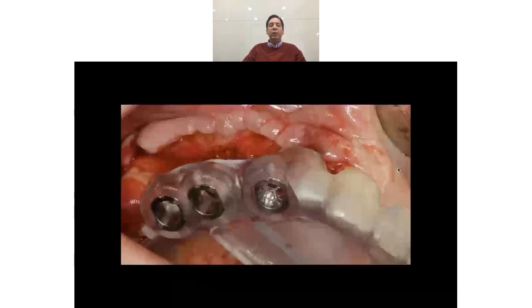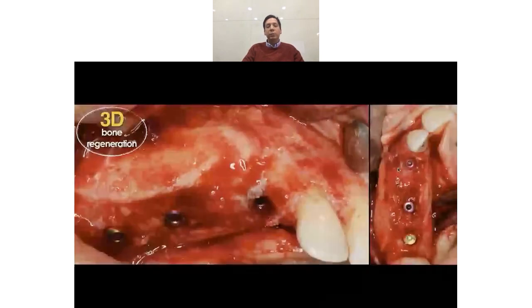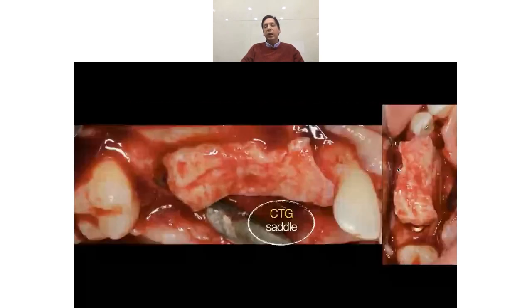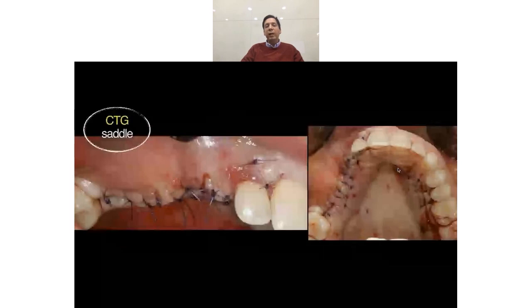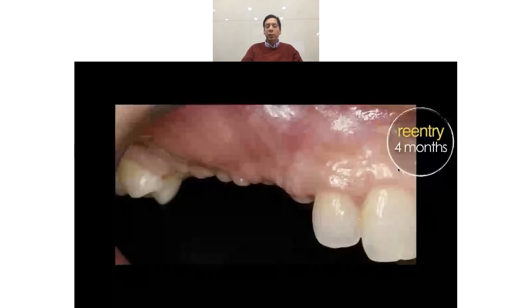And we have no problem to place three implants, one in the canine, one in the second premolar, and the other in the first molar. The first premolar was going to be a pontic. So we can see here the three implants. And we place a connective tissue graft that we harvest from the other side of the palate, and we left the implant and the CTG submerged.